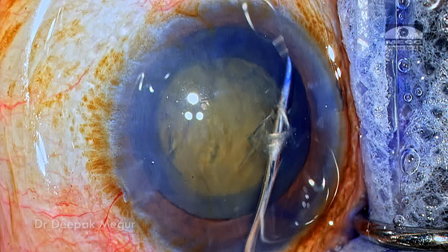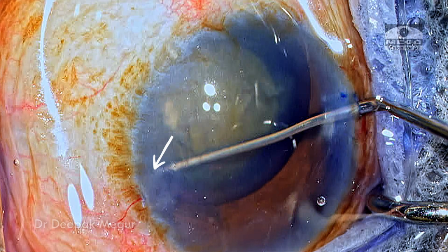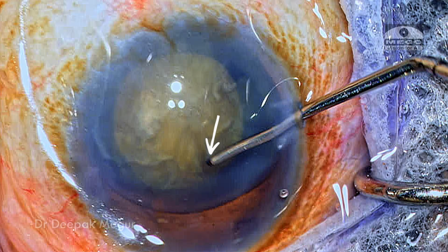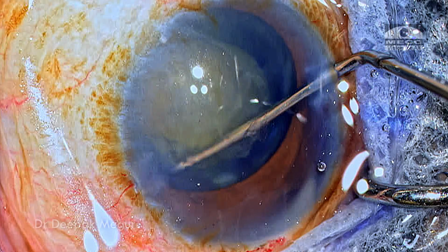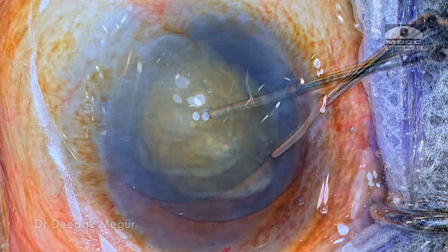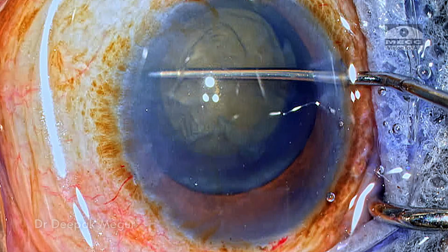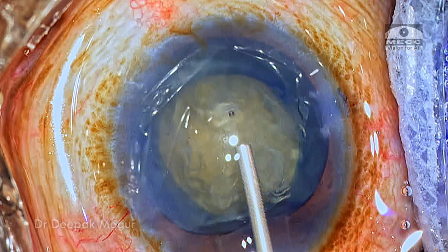So the hydrodissection is done and I'm trying to rotate the nucleus. It is slightly difficult, but the moment I keep my chopper in the mid-peripheral region and then rotate, it rotates quite easily. So the anterior zonular health was reasonable in this patient, although there seems to be a generalized zonular weakness which can be expected in this age group of patients.